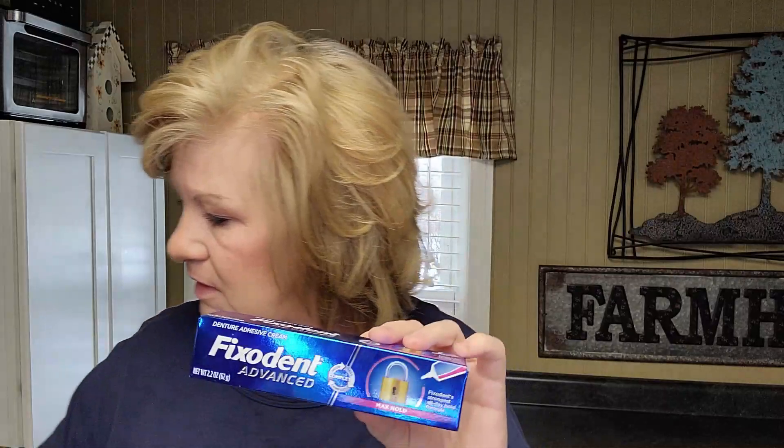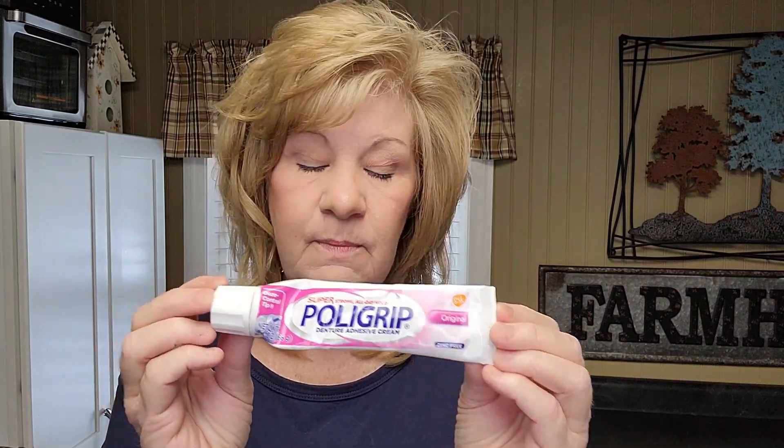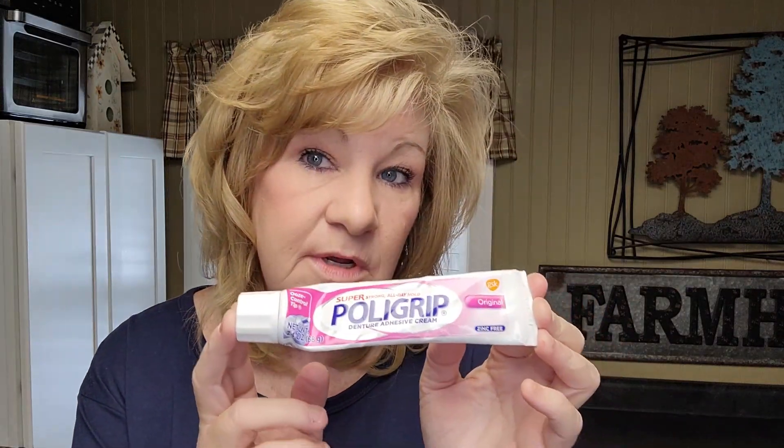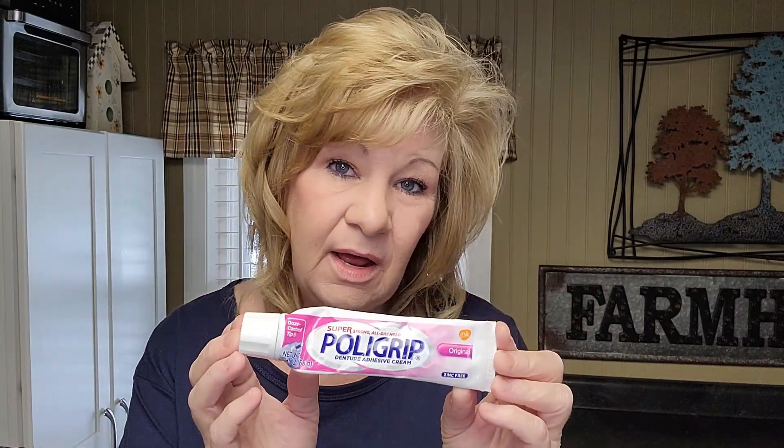My next very favorite is Fixodent Advanced — you can buy this over the counter. This is really super good, it's close to the Secure. Same goes for the bottom denture: put a little powder in it and it works great.